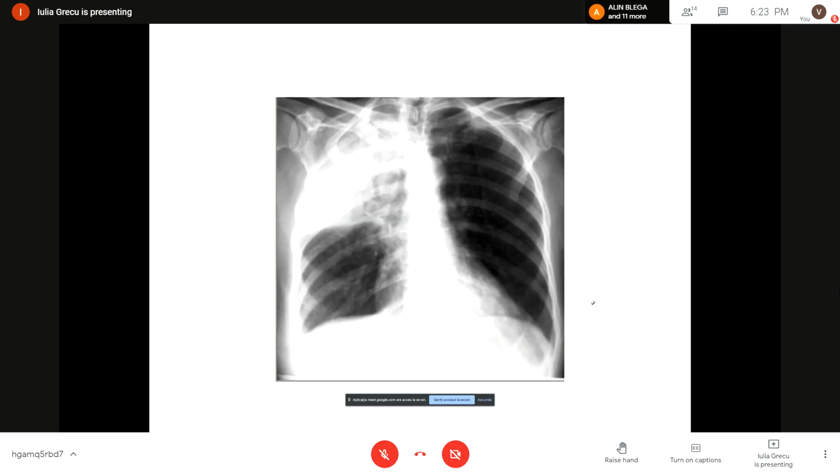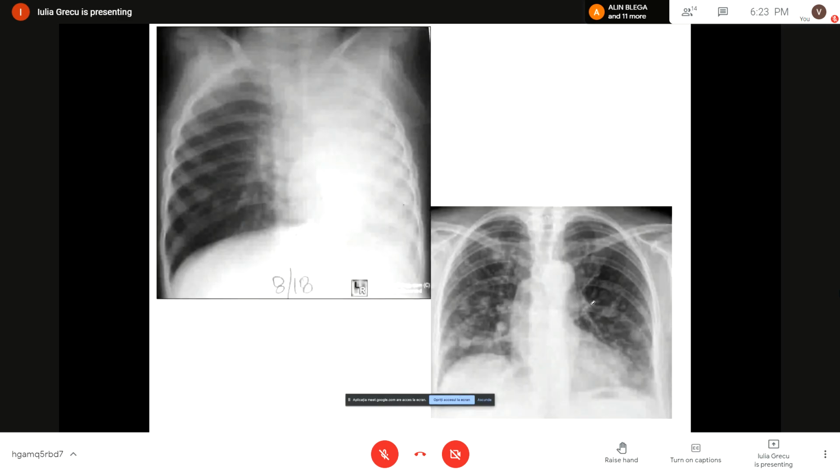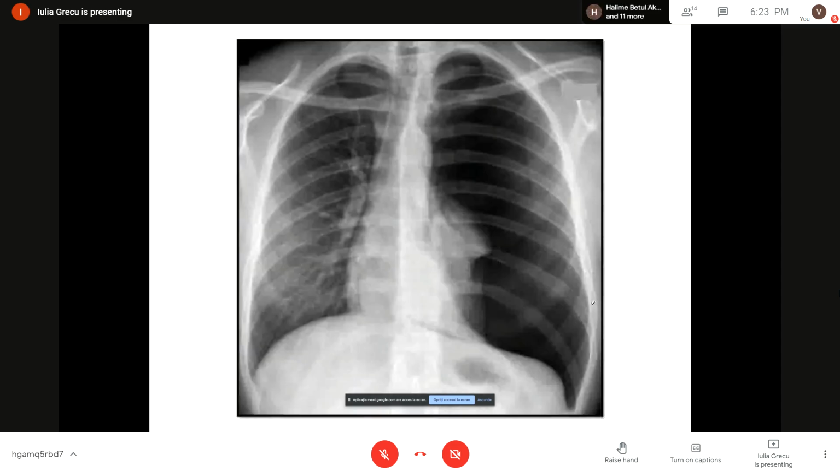So these are the main things that we will deal with in the pulmonary workshops. We will take each one separately and discuss it until we find a way to learn them and to recognize them.